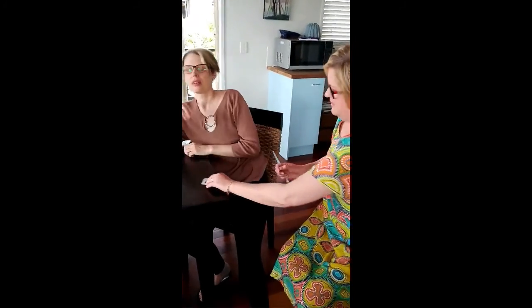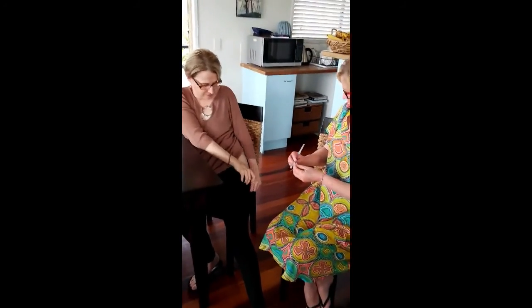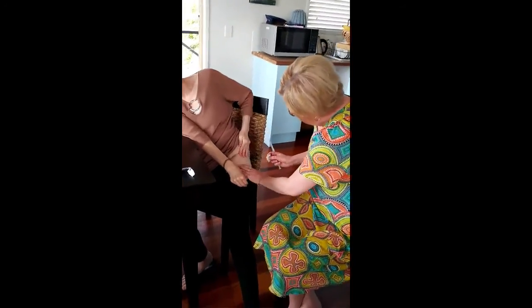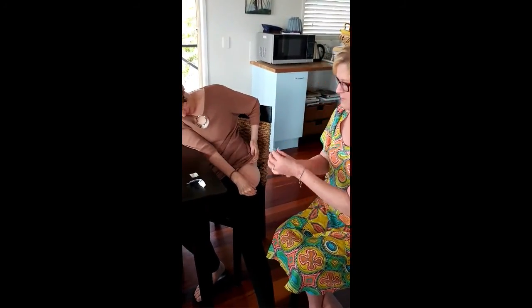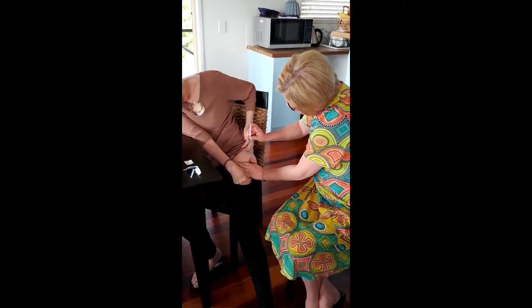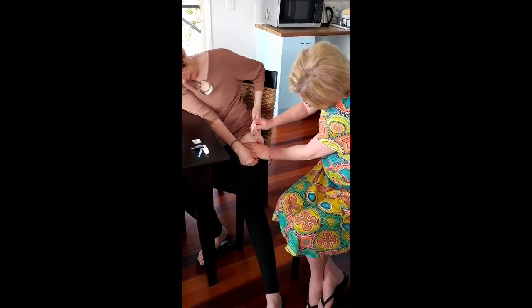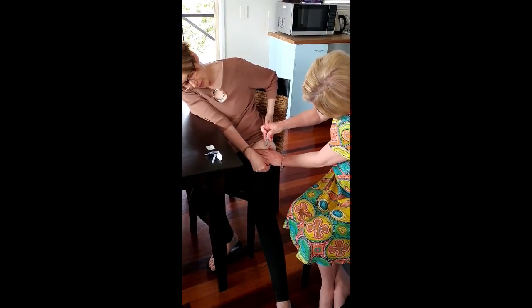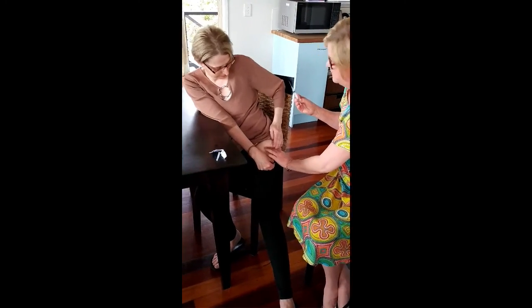Desi is going to inject me now, pulling the skin taut and making sure there's no blood — that's going to be okay. Done.